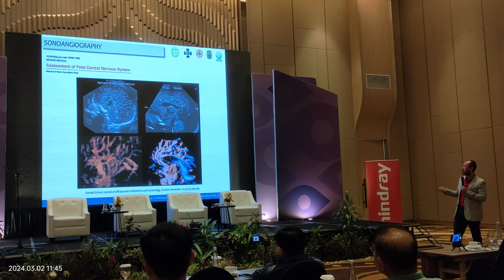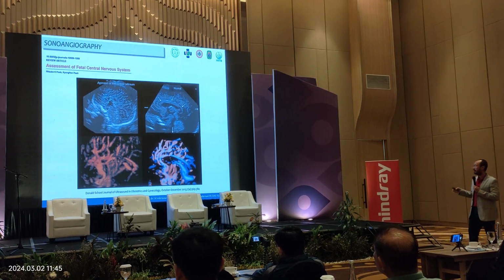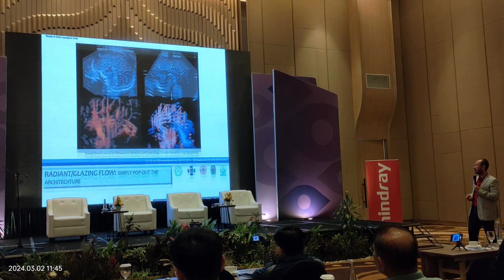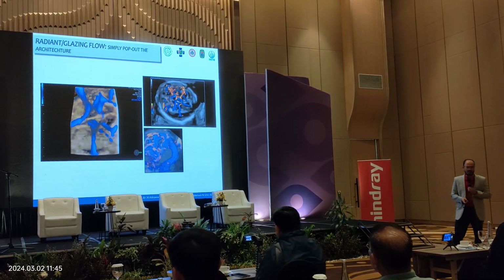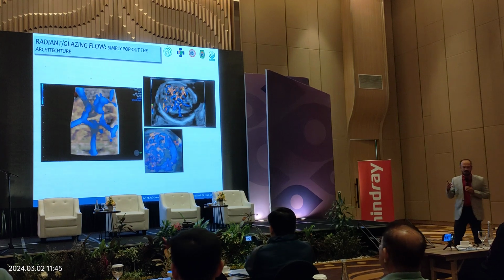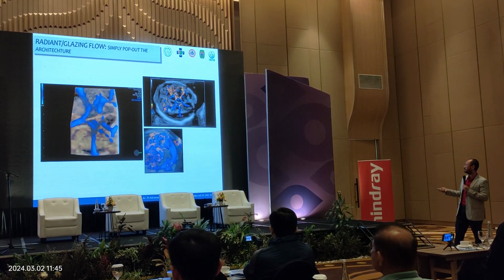Okay, this one is from research also. How can we differentiate between a normal corpus callosum and agenesis of corpus callosum by examining the pericallosal artery and also the callosomarginal artery. Okay, and technology is developing higher and higher. Like this is the vein of Galen malformation. We can see very clearly the turbulence of the blood flow until it drains into the sinus sagittalis.